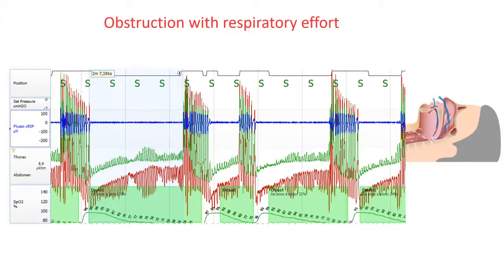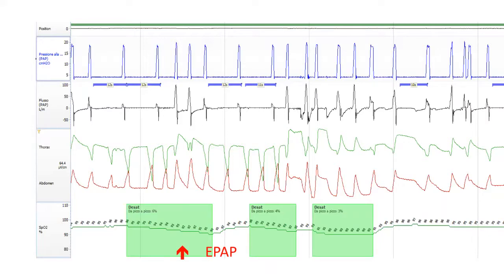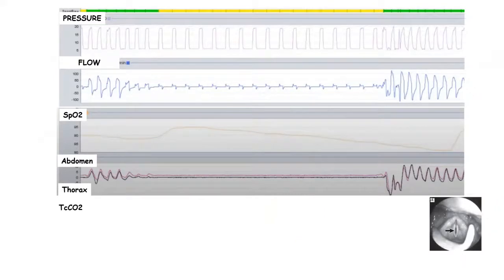In the first case — with movement and thoracoabdominal paradox — the main mechanism is classic oropharyngeal obstruction. You can see that the ventilator pushes even in controlled mode but there is no flow, and the abdomen and thorax are fighting with the ventilator, out of synchrony. In this case I need to try to improve narrowing of the upper airway, so I should increase the EPAP value.